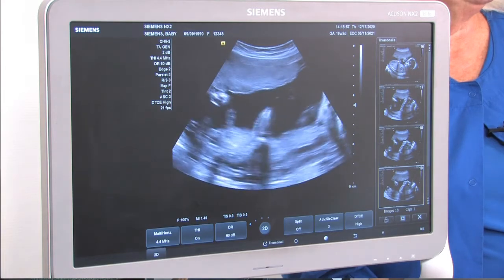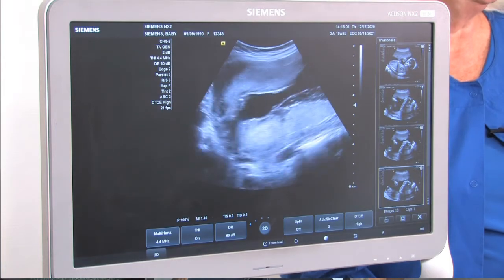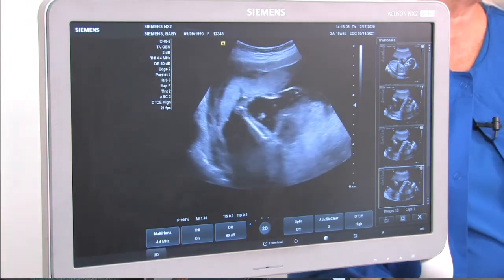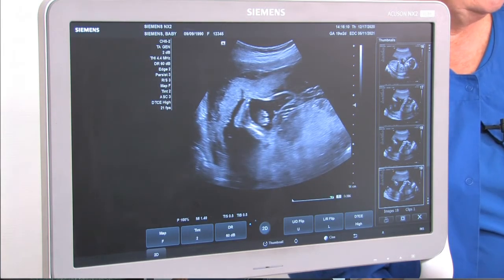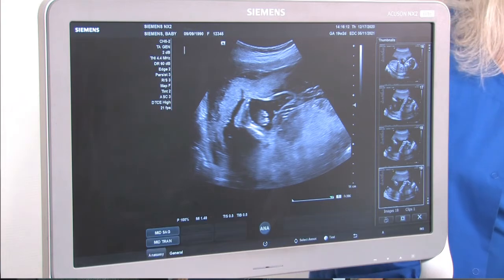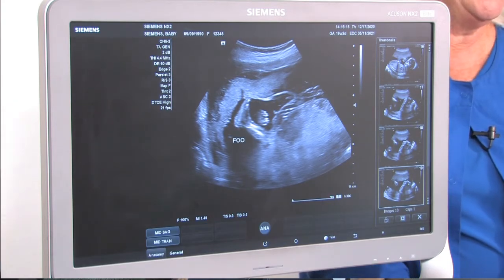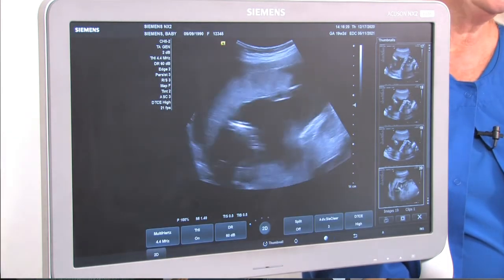The feet are up here by your stomach. Oh, look at her foot. That's why I feel stuff up there. Yeah, you're getting kicked. Look at that leg. Oh, that foot, big foot. It's like you're getting kicked, and here she goes. There it comes. All right.